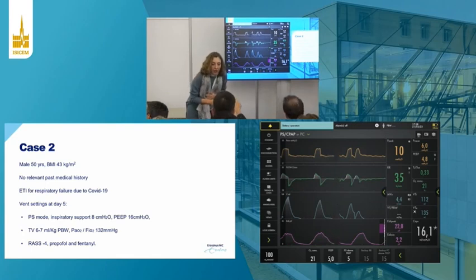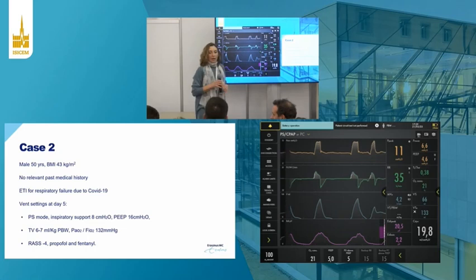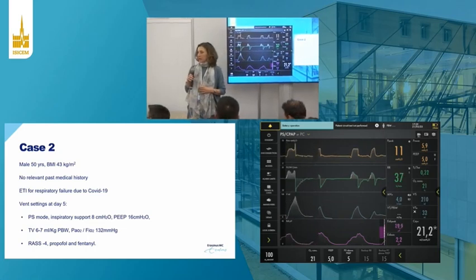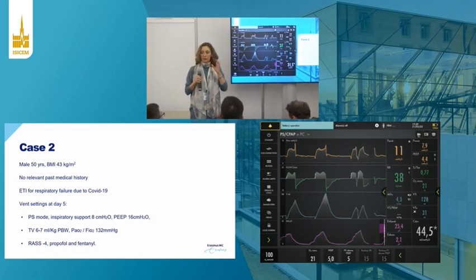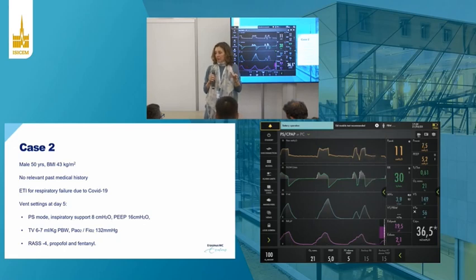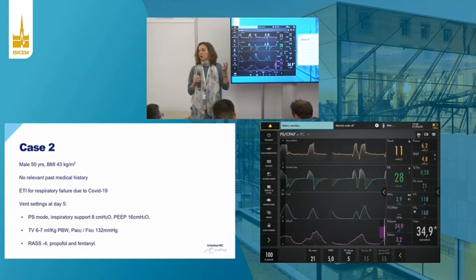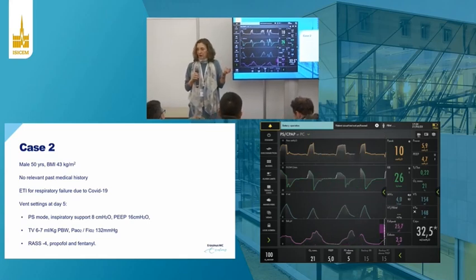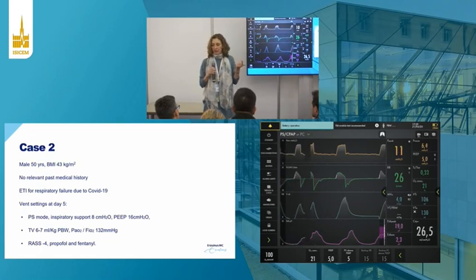How to solve the double triggering in the ventilator? Okay. Can you repeat the question, Katerina? So the question is how to solve the double triggering on the ventilator. So in pressure support, we manage inspiratory time by 3 things, because inspiratory time depends on peak flow, which again depends on patient effort, that's not in our hands, on the level of assist we provide, that's in our hands, and the cycling off criterion. It also depends on mechanics, but that's also not in our hands. So what we have in our hands is the level of assist and the cycling off criterion.